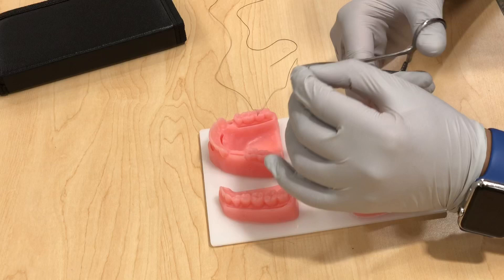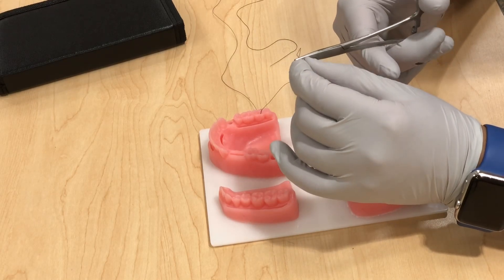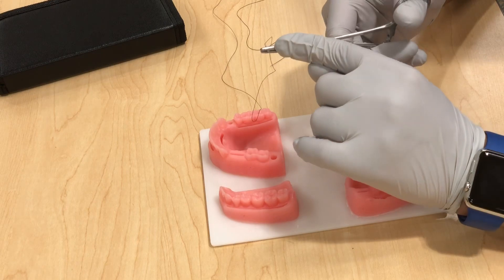This is a nice little kit you could practice on at home. I used to practice a lot in my sophomore year, especially when I was transitioning to clinic — it was very helpful. I highly recommend it. The best way to hold the needle is two-thirds of the way from the tip — not at the end and not at the tip.